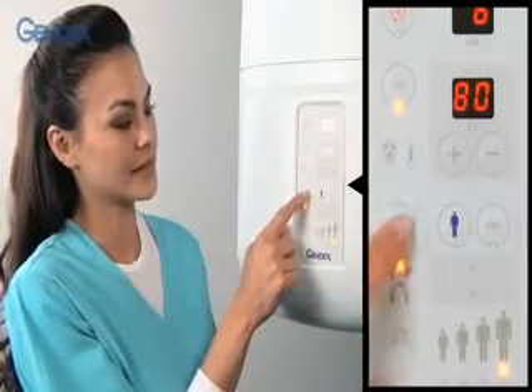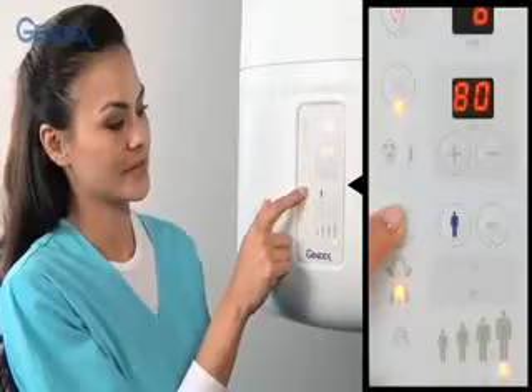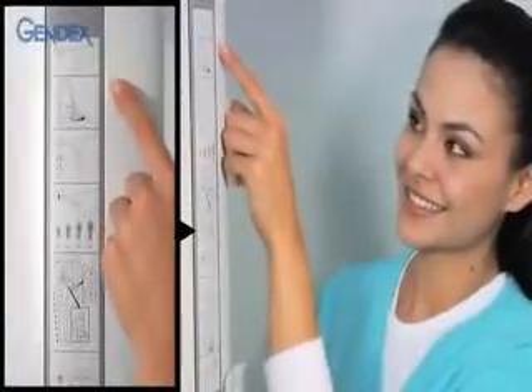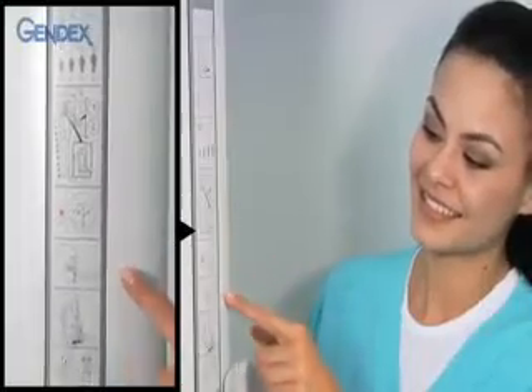Select the exposure — either pan or one of the TMJ projections — by pressing the function button. For convenience, instructions for taking images are located on the unit itself.